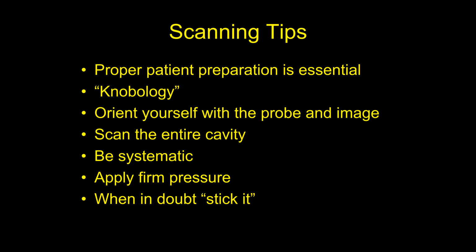Well, you're going to get animals that come in, and the owners with those animals, and you're palpating a mass in the abdomen of this dog. And you say, well, the next thing we need to do after we did our radiographs, we need to ultrasound it because we need to look inside the liver where this mass is coming from and see what it looks like and maybe get a biopsy of it. And the owner is going to say, well, what do you mean you have to clip the hair on the dog? Okay. Ultrasound does not penetrate through hair.